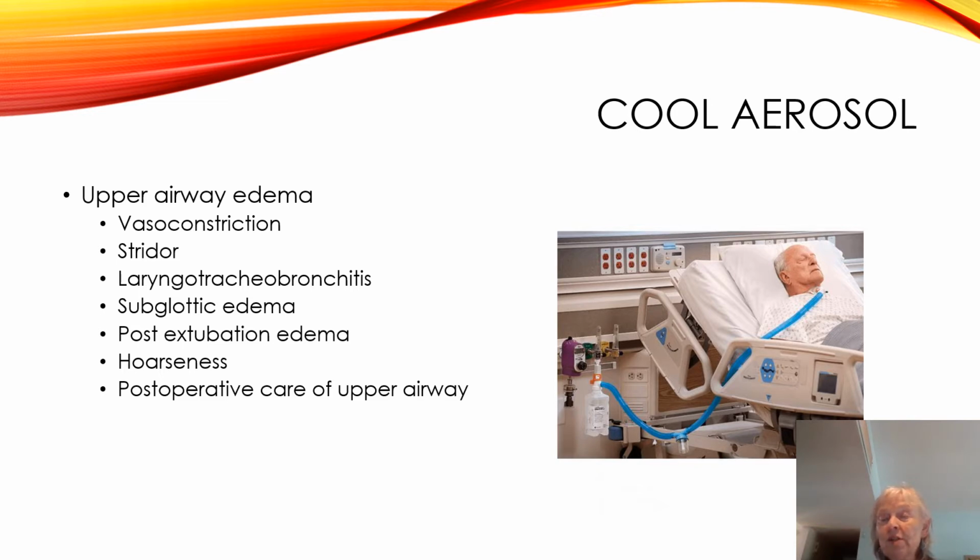Do we always use heated aerosols? No. Do we always use cool aerosols? No. A lot of it depends on what's wrong with the patient and what we're trying to do with this patient. One of the problems with cool aerosols, it sometimes causes bronchoconstriction, a little bronchospasm. We definitely have to be careful when we're doing this so that we don't cause problems with the patient.